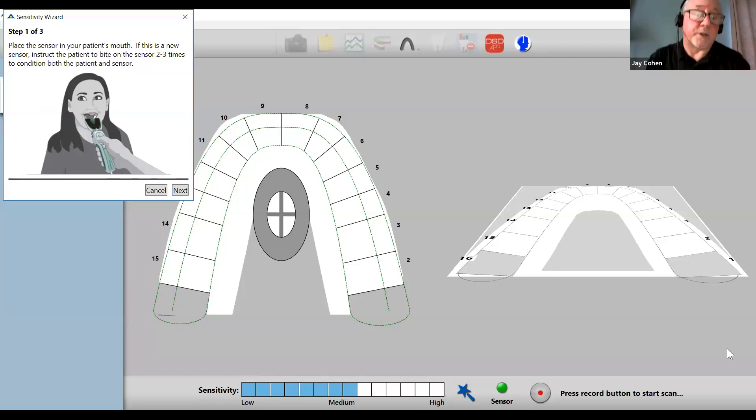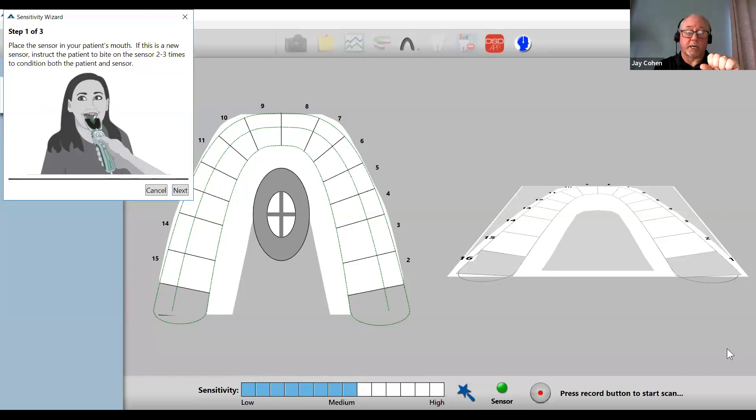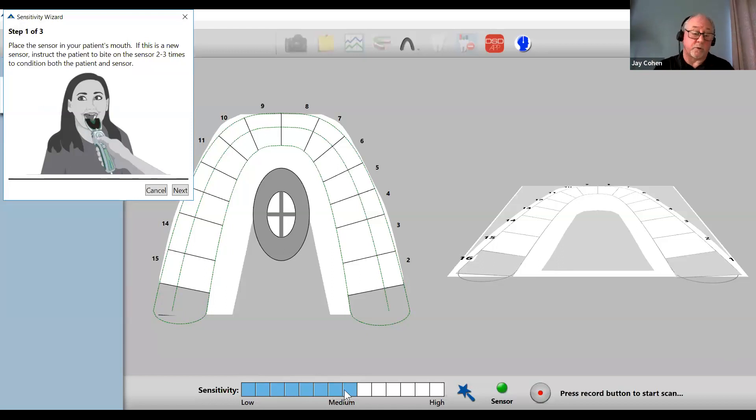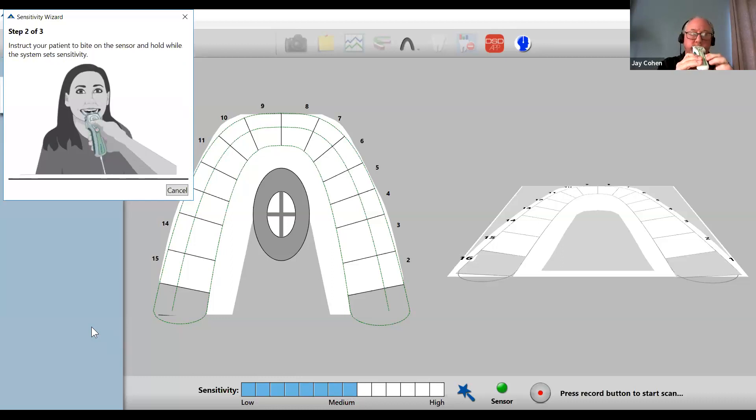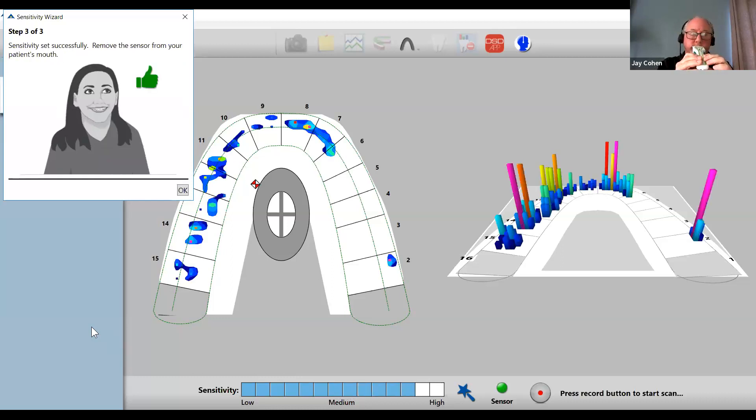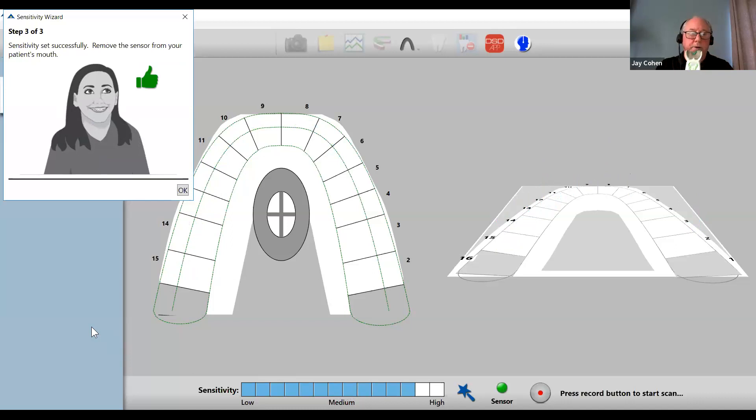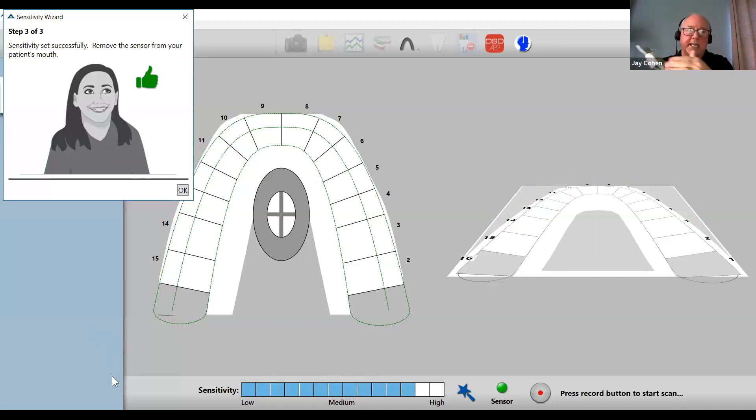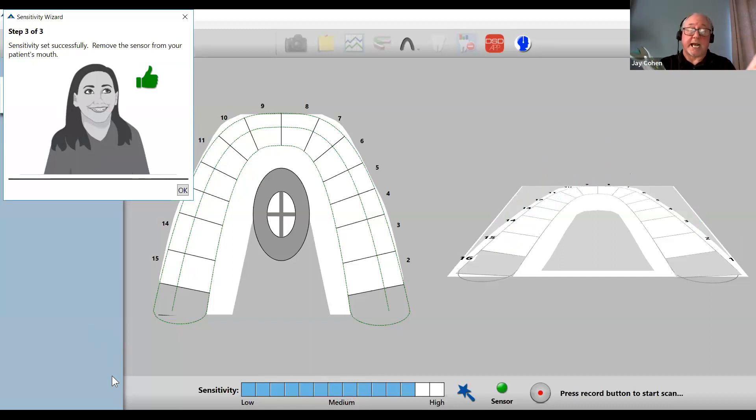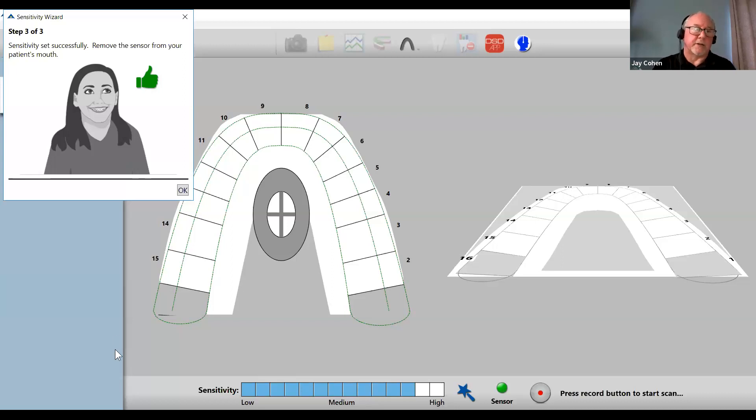What I'm going to demonstrate now is what happens if the patient bites too slowly. Right now, the wizard set the sensitivity to four out of 14 levels. That's the appropriate level for me. But if I was to bite too slowly, the sensitivity wizard did not wait for me to achieve maximum force. So it set the sensitivity while I was on my way to getting to maximum force, but I didn't get there, was probably maybe half of my total force. So the wizard thinks that I don't bite very hard and set it way up.